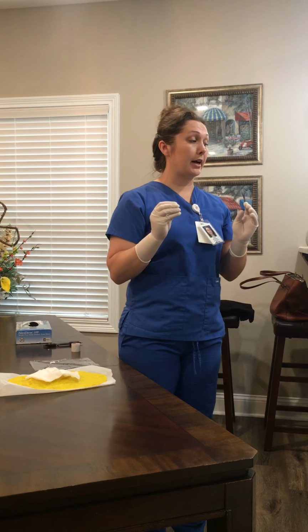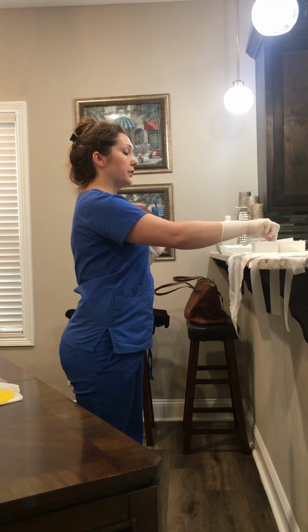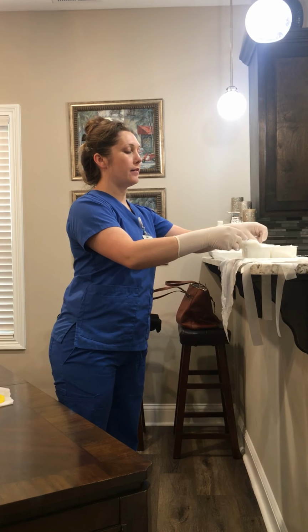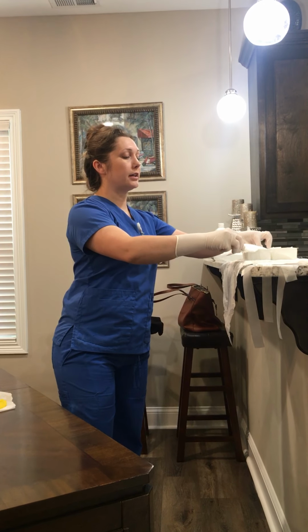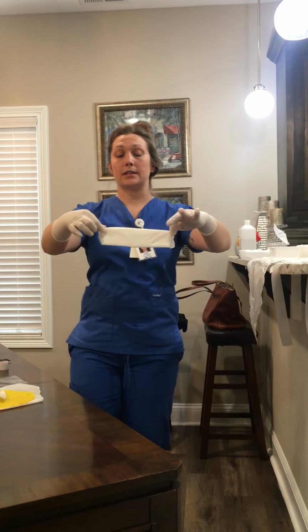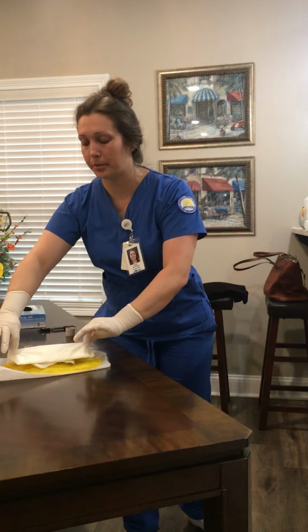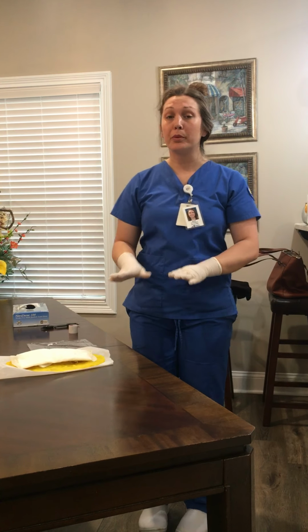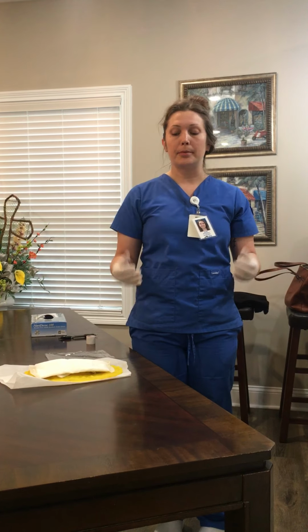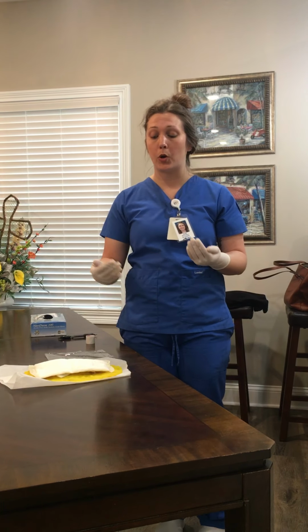And now I can apply my ABD pad. I'm just gonna reach into my sterile field to grab my ABD pad. The ABD pads have a blue flap on it that helps you grab it, and that also notifies you that that's the top, blue, the sky, so that should go on top. And you're just gonna place that over the wound. Once you place it over the wound, you no longer need to be sterile, but I'm gonna keep my gloves on anyways. Now I can place the tape over my wound.